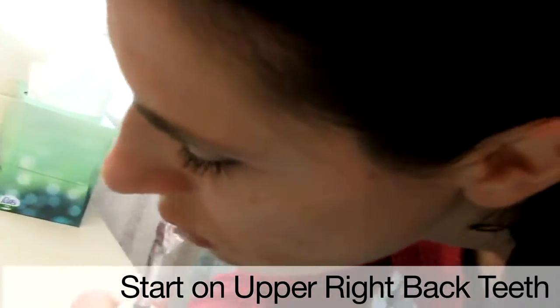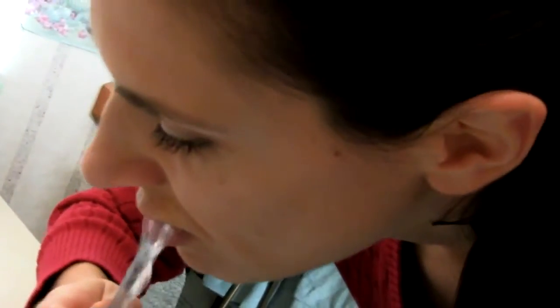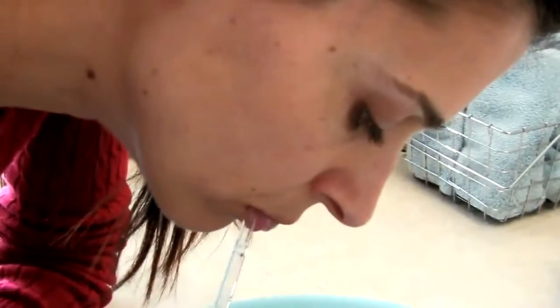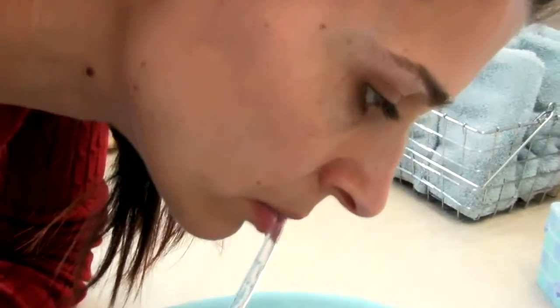Slowly progress around to the front teeth and then the back teeth on the left side. Now inside, run the water jet along the gum line at the same angle. You can press the blue button with your thumb to pause the water flow while you switch from the top teeth to the bottom teeth. Another great smile kept healthy by Waterpik. Thank you.